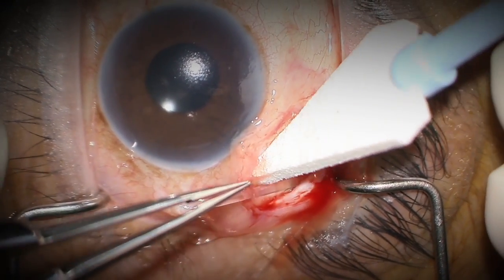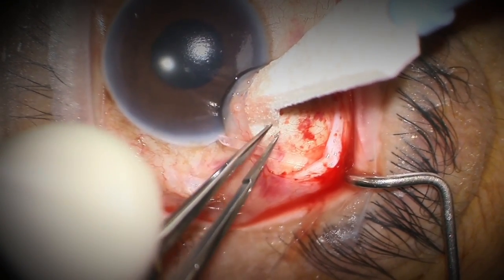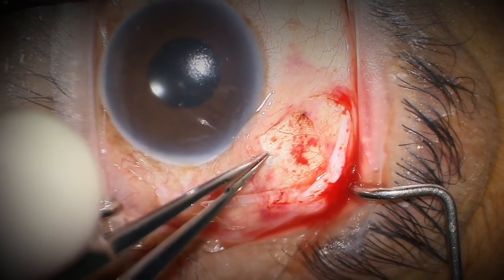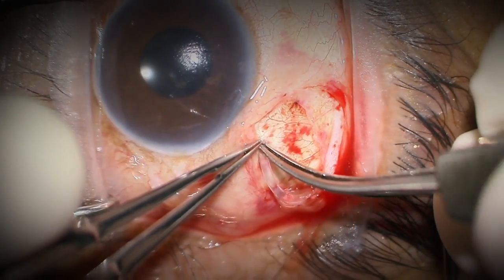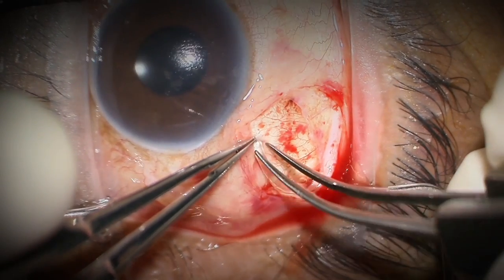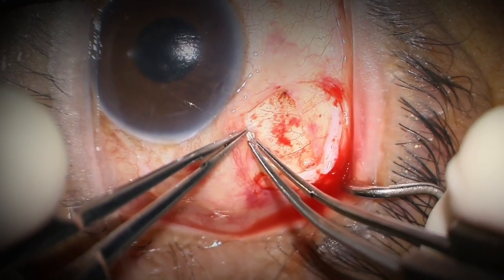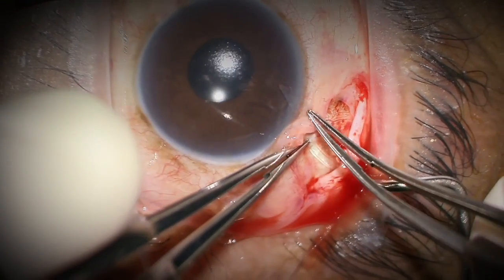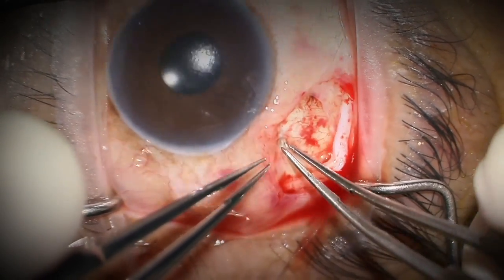I open up the 23 gauge flap with a 0.12 forcep and use the smooth forcep to place the tube tip into the tunnel. I want this fit to be tight, and I'm using a curved forcep because if the fit is very tight the curved forcep does a better job of squeezing the tube to get it inside the tunnel. You can see the tube is in about a millimeter and it's not going anywhere.